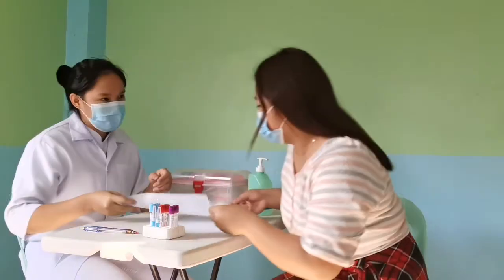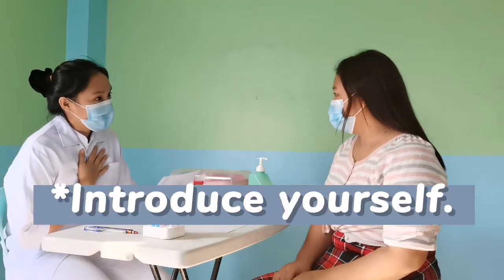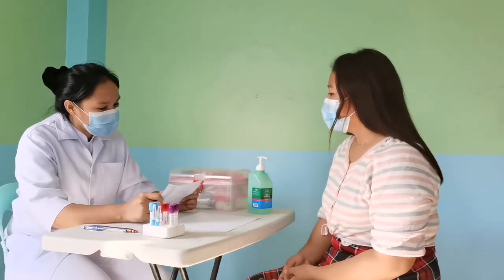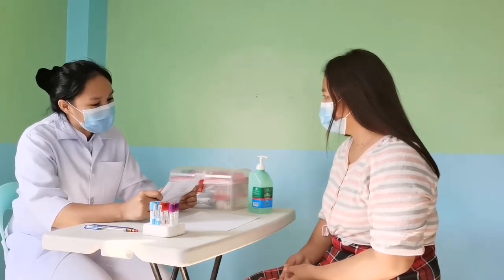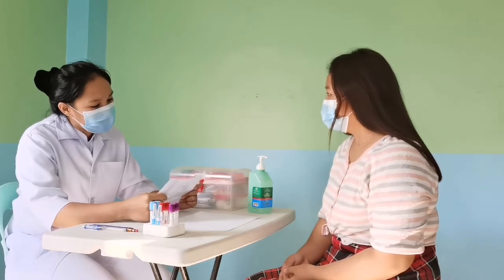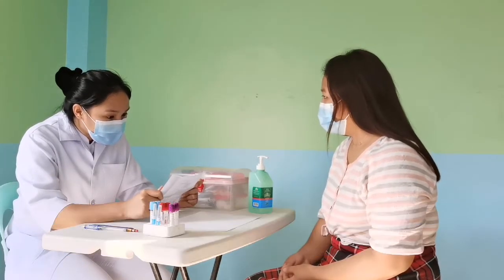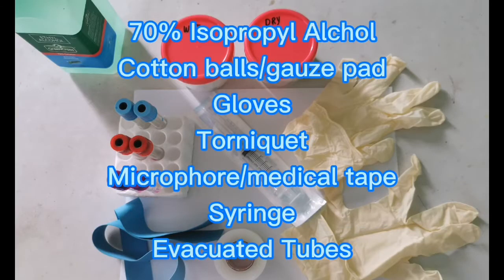Step-by-step venipuncture procedure. Let the patient state their name. Compare this information with the information on the request form. After patient identification, prepare all the materials needed.